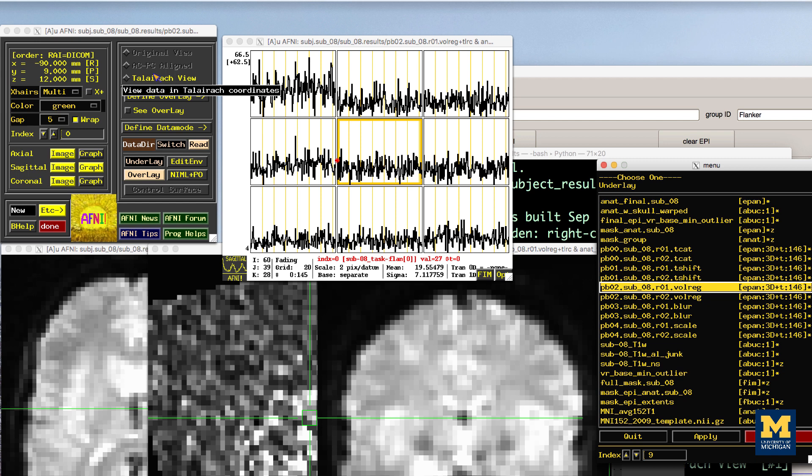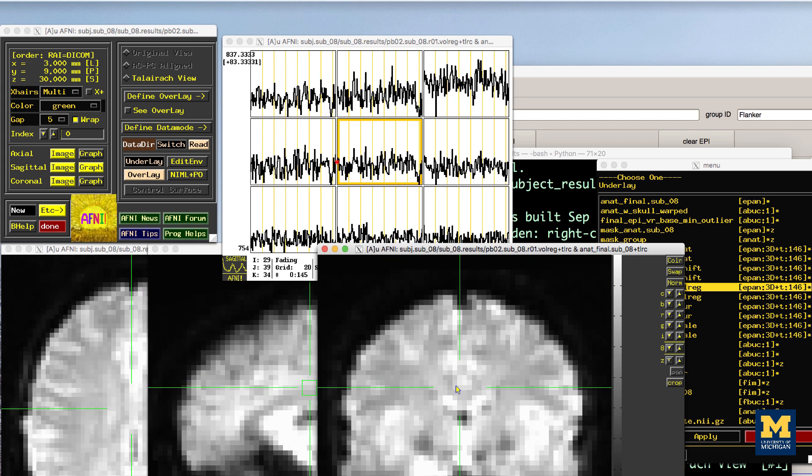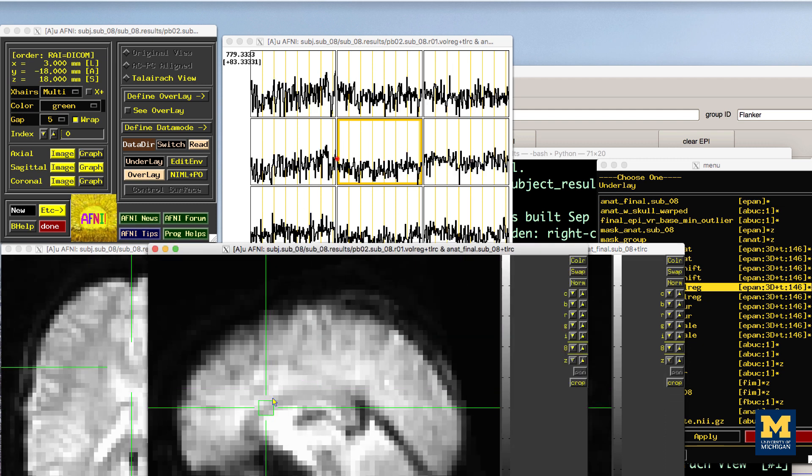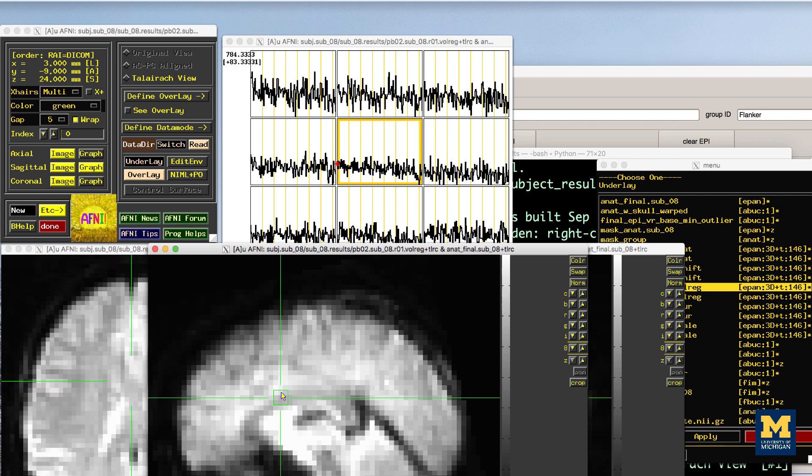When you view this processing block for other subjects, the basic shape and outline of the images will look nearly identical, since they have all been warped to the same template. Again, check the images and the time course in a few different locations to make sure there are no obvious artifacts.